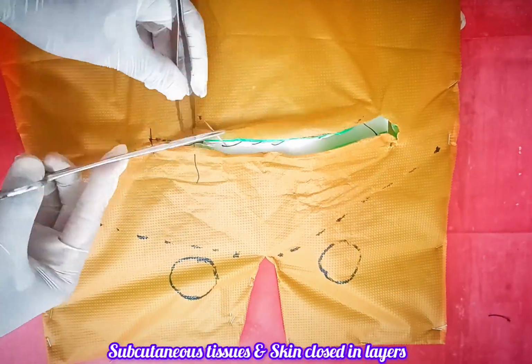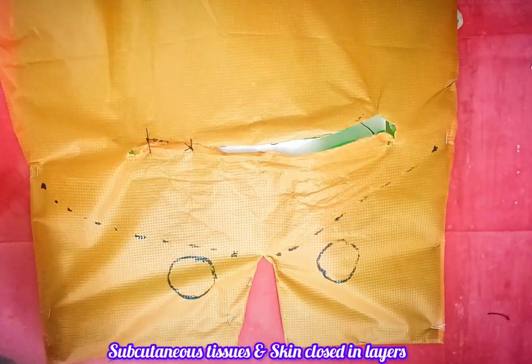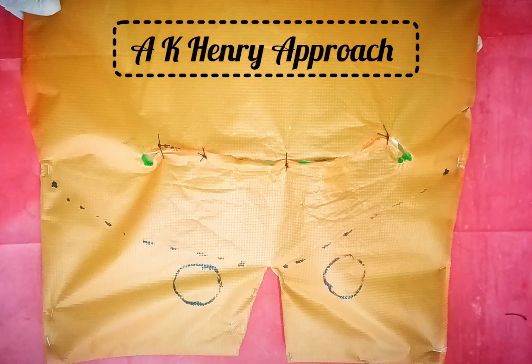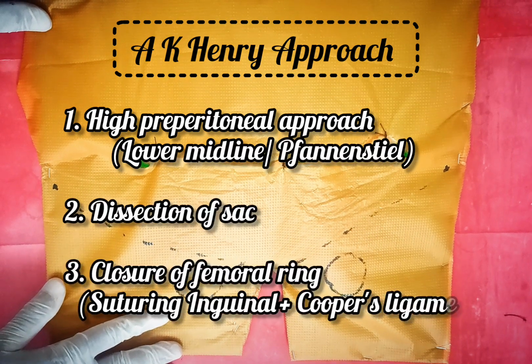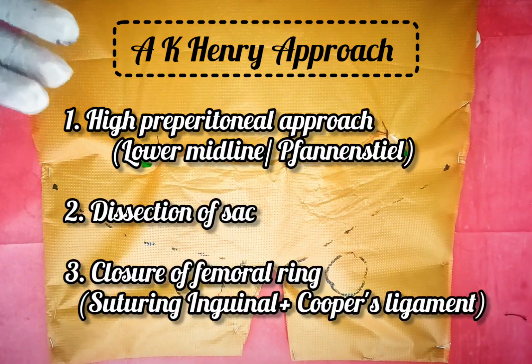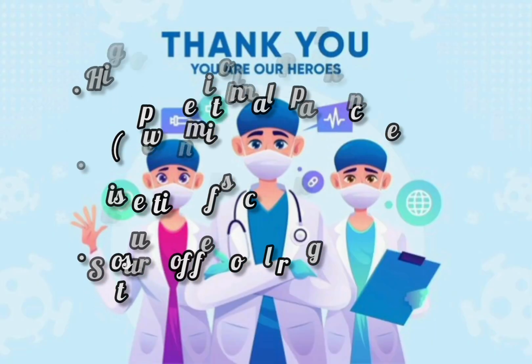Subcutaneous tissues and skin closed in layers. This completes A.K. Henry's approach of femoral hernia, and key steps include high preperitoneal approach through low midline or Pfannenstiel incision, dissection of sac and closure of femoral ring by suturing inguinal ligament to Cooper's ligament. Thank you.